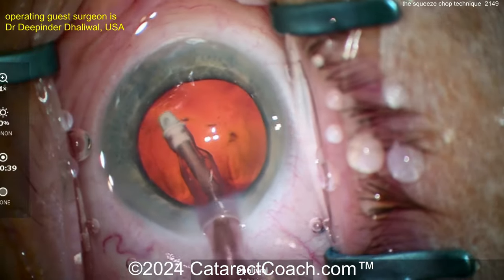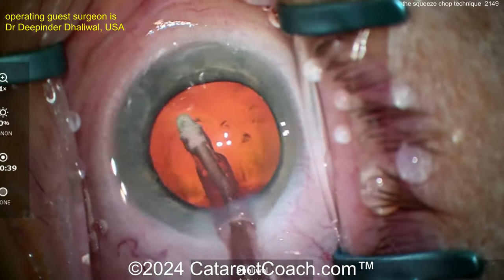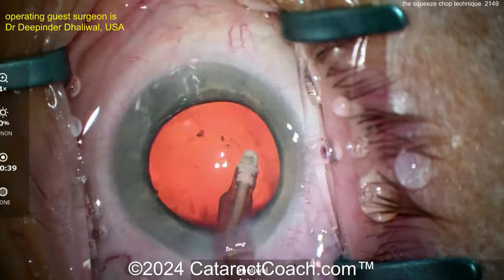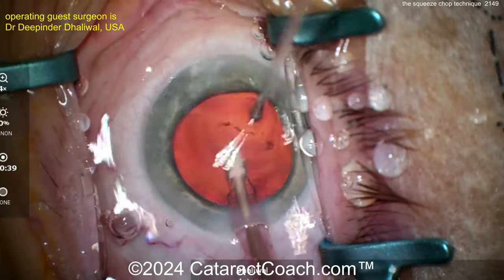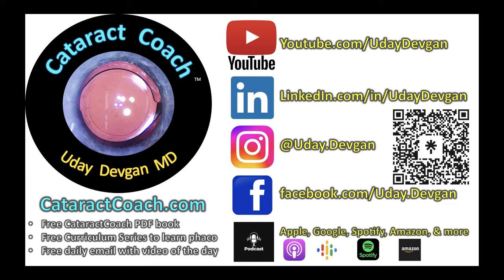You are doing the chop literally at phaco foot pedal position one, just with infusion, trapping the nucleus or squeezing the nuclear half between the chopper and the phaco tip — that's the squeeze chop technique. I encourage you to try this technique even if you already have great phaco chop skills; it's good to have more tools in your toolbox. Please come to ASCRS, April 6th, and learn from Dr. Dhaliwal and Dr. Bragamili. Check out the CataractCoach.com website and podcast — so much to learn.